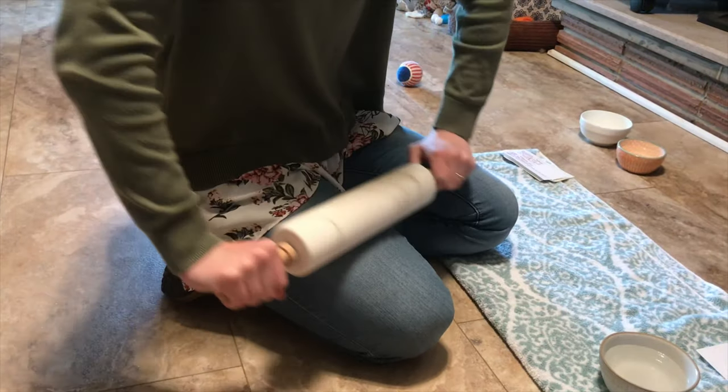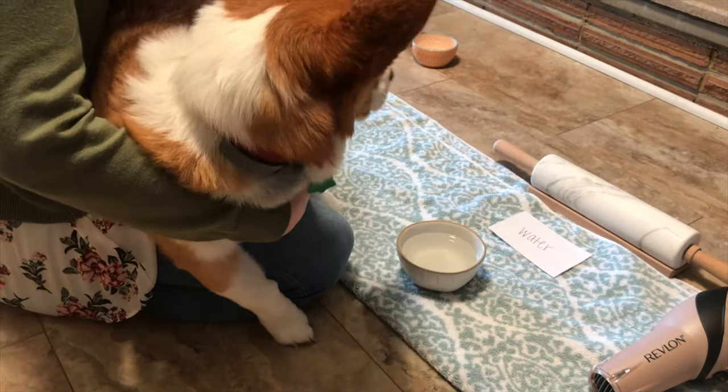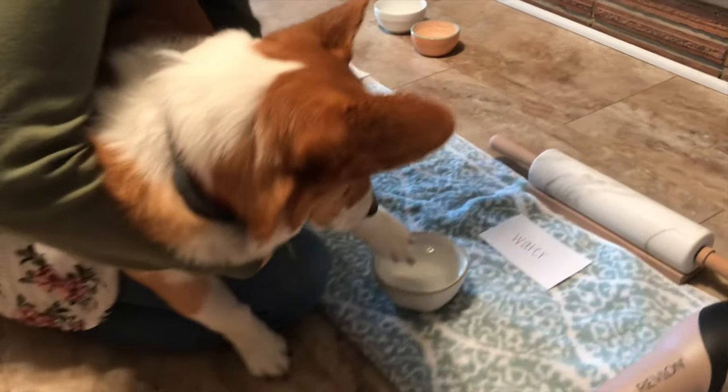Then we'll roll into the water next. The next step is to rinse off the film in water.